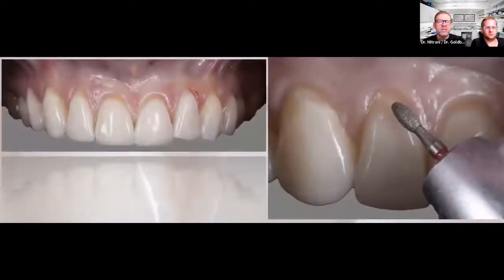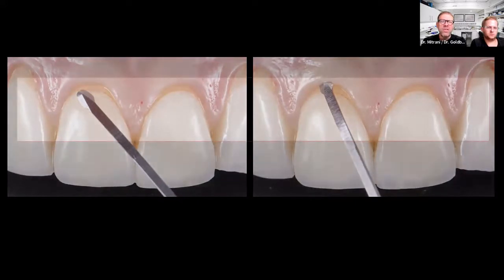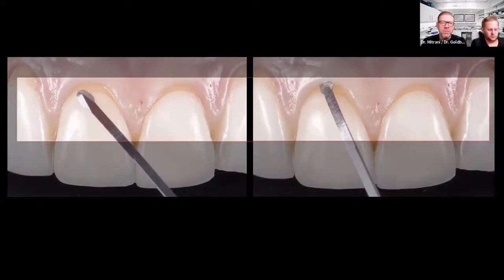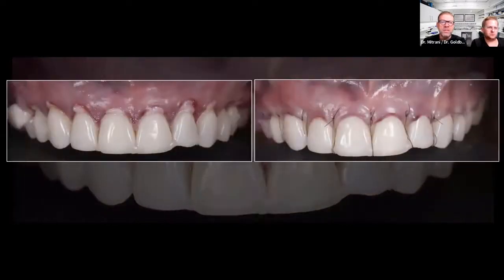Now, this is a procedure that Jack and myself didn't do. This was carried out by Dr. Salvador Garcia, a phenomenal periodontist here in Mexico. And we start out by undermining the contours of those ceramic veneers. We're creating enough space so that now our surgeon can go in with micro blades and carry out this dermal matrix grafting protocol. Here you can see the dermal matrix and how he's beautifully now positioning everything in place.